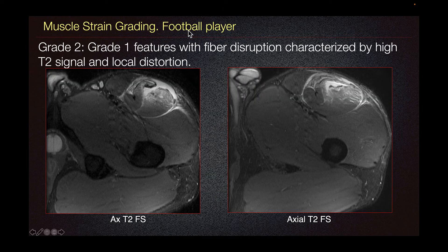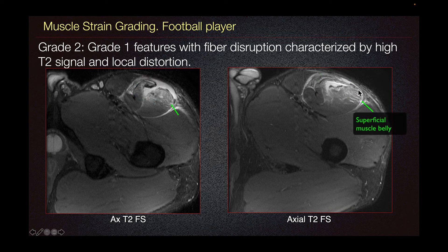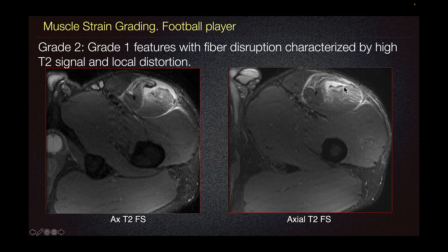This is a different football player demonstrating a grade 2 strain proximally. We can see significant edema and feathery appearance of the rectus femoris, involving the inner muscle belly but also the superficial muscle belly arising from the direct head in the anterolateral aspect of the muscle. These findings are consistent with grade 2 strain, which has grade 1 features with fiber disruption, as we can see in this area.